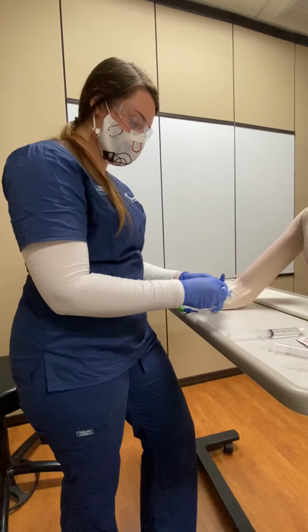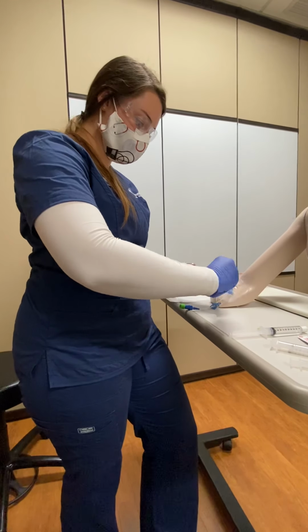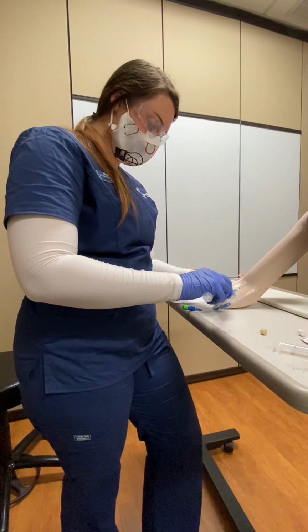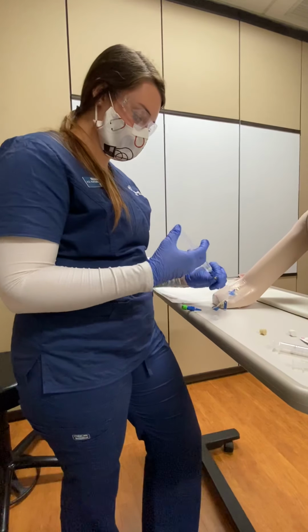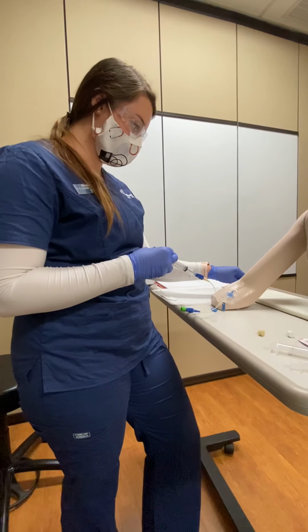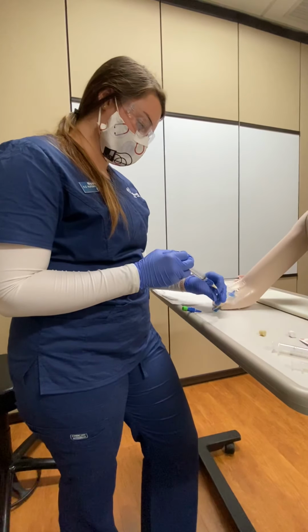Clean again. Okay, and now this last flush, I will give pulsating, generally around 1 milliliter at a time. Okay. I'm going to lock it.